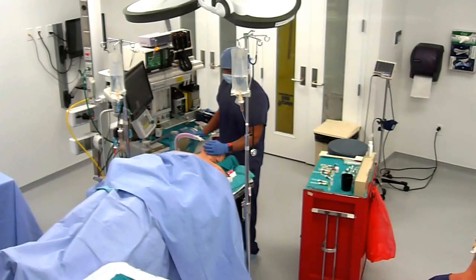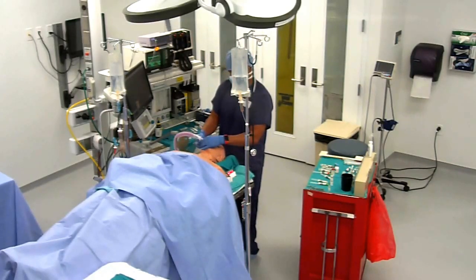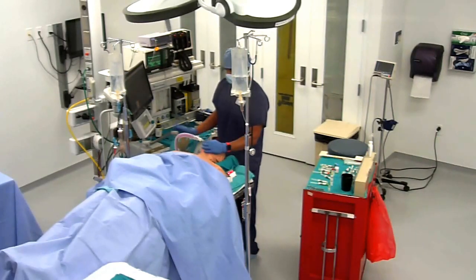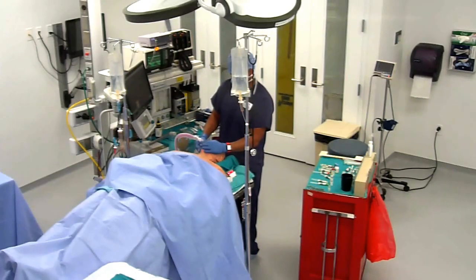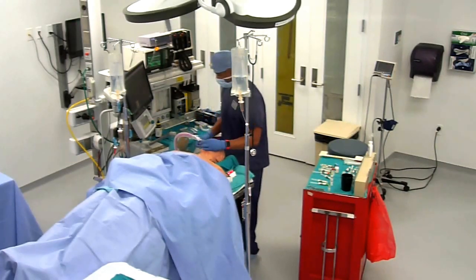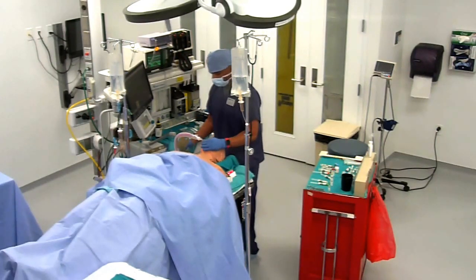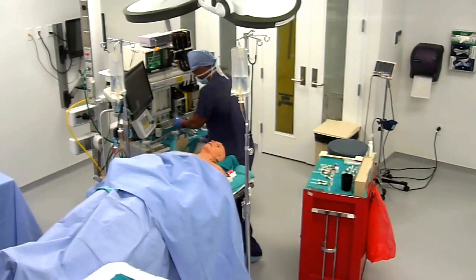Okay, so I'm suctioning, and get my 10 mil syringe back on, ready to, when I extubate, I want to extubate with positive pressure. So I want to deflate the cuff. And, all right, we'll get that tube out here in 1 second, Katie. Okay, put it in my little face mask, my syringe. Okay, big breath on 3, on 2. Positive pressure, and then a suction. Cough, cough, cough. Good job, good job. Take it off. And put back on the mask.